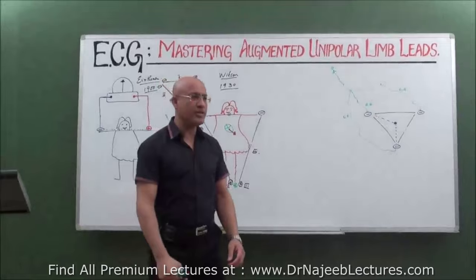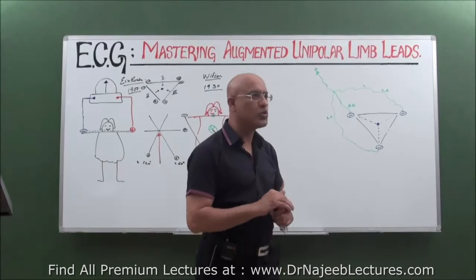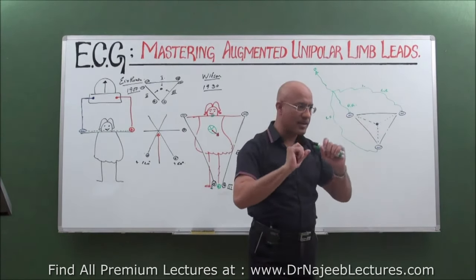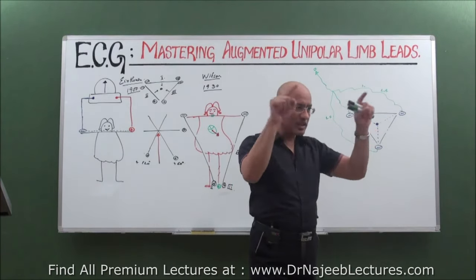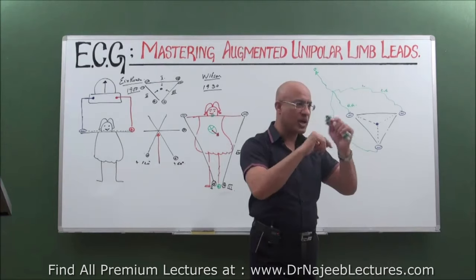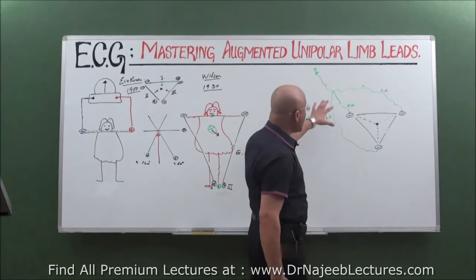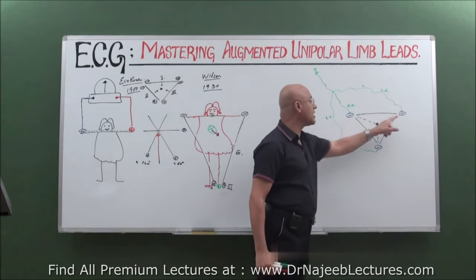Wilson and his friends used the concept of geometry and mathematics. If there is an equilateral triangle, and you pick up the current from the three apices and add them together, they will cancel each other and end up with potential almost zero. And in that case, we cannot say that the electrode is here or there.